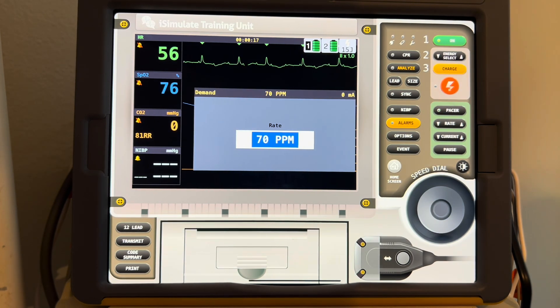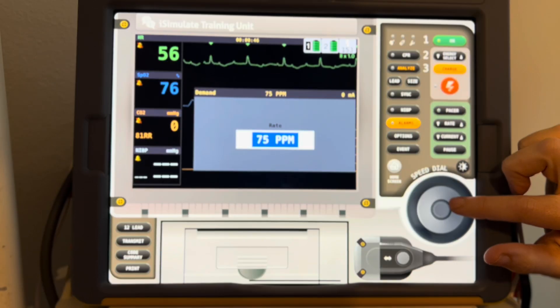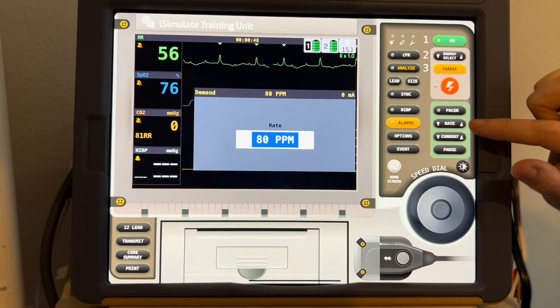Now, you're going to want to decide what rate you're going to want to set your pacer at — what is the heart rate or pulse that you will be able to palpate on this particular patient? So with this patient, they've been riding at around 56, so you may want to go to around 70 or 80. Or, if you feel like or see later that they need a higher heart rate in order to do better, you may dial your rate up at that time. So let's say we decided on a rate of 80 — we can dial that up right here, or you could hit the buttons.